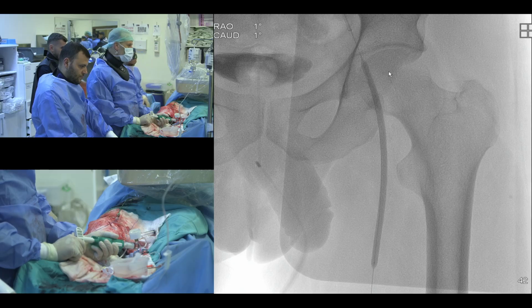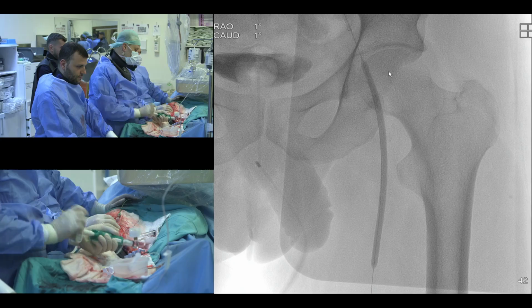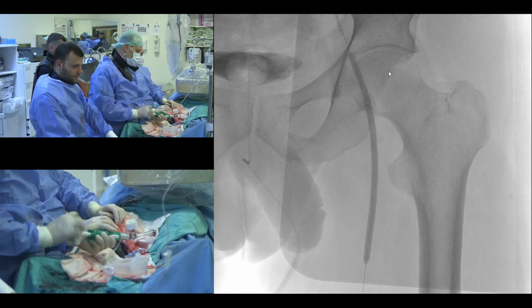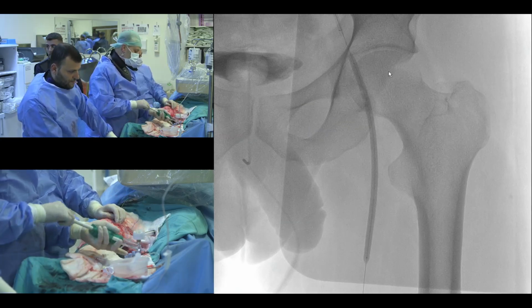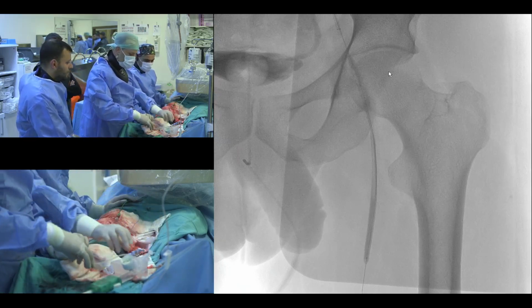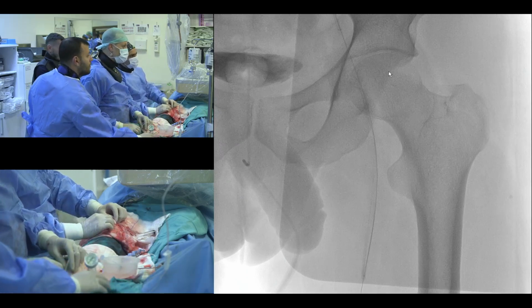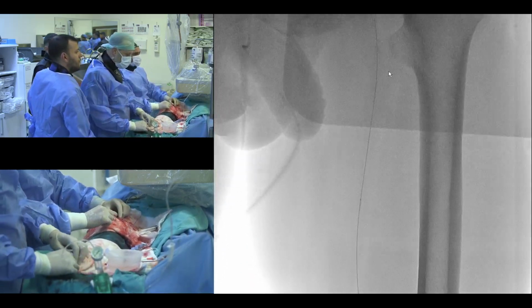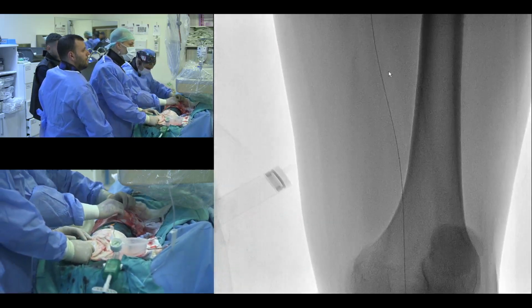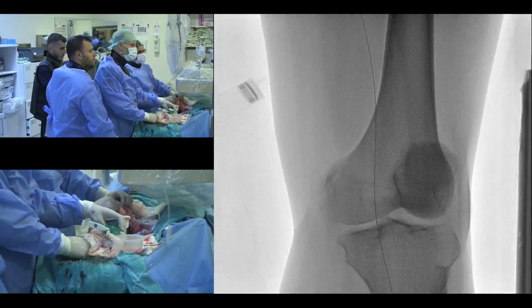So it is the impressive part of that case. Let's do another DSA. Now, as you see, we are in the true lumen. Okay, that's a chance.